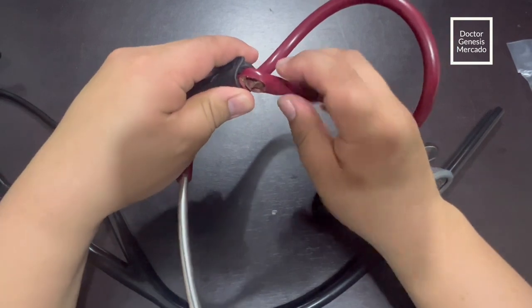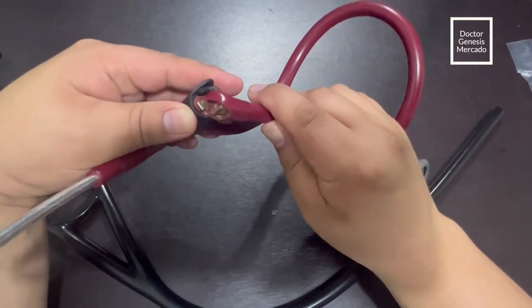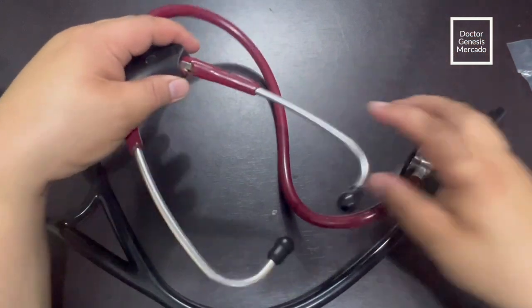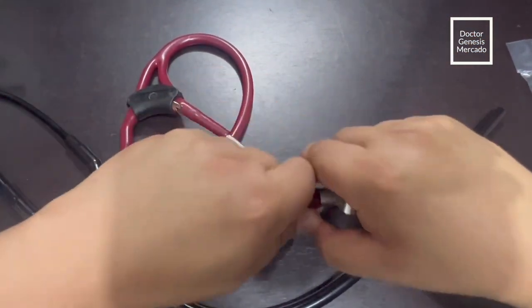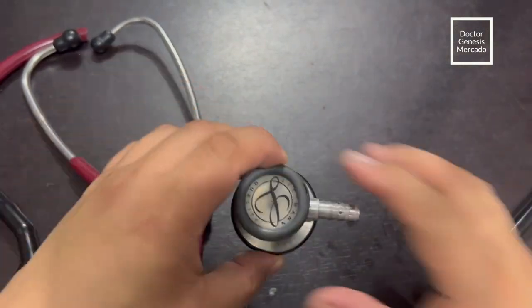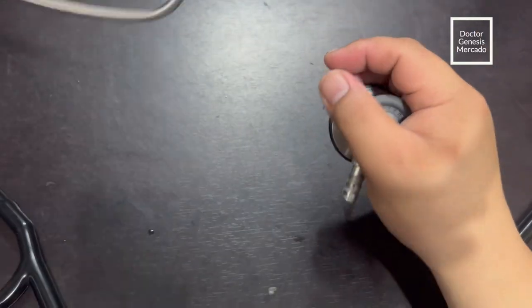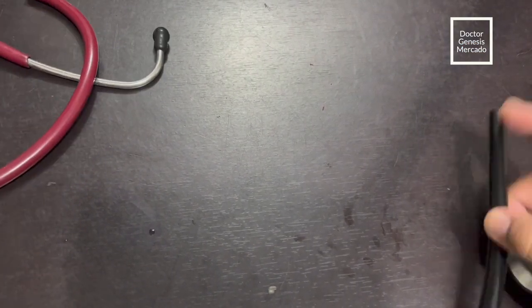It is already damaged. Okay, see? I hope you can appreciate it. Damaged stethoscope. So we will just remove this one. We'll just pull it. Okay, so this is the chest piece. This is my old damaged tube. And now, this is the tube that we bought.